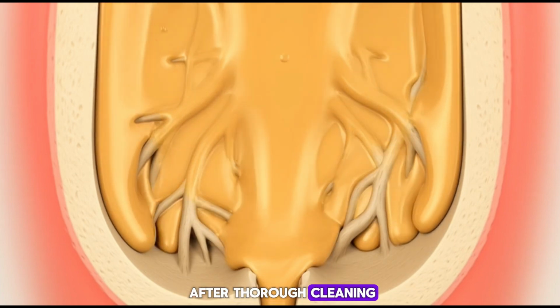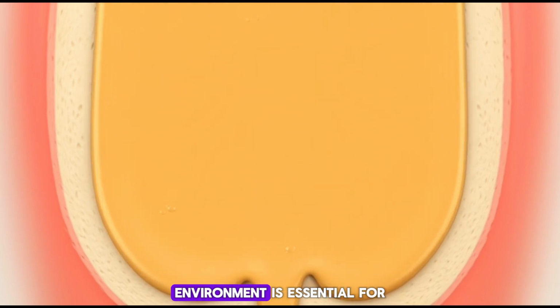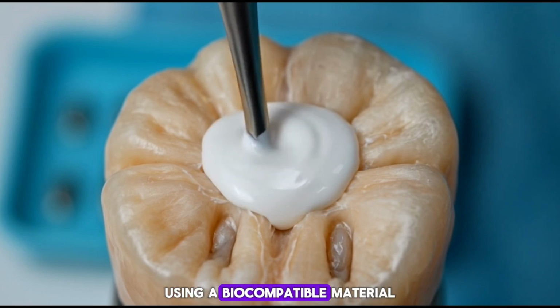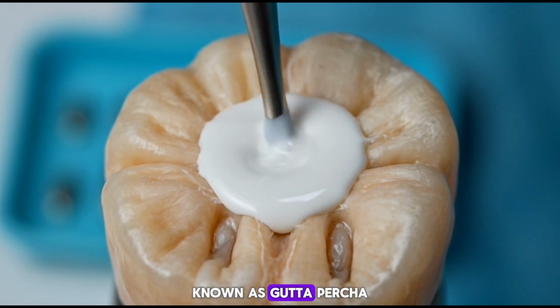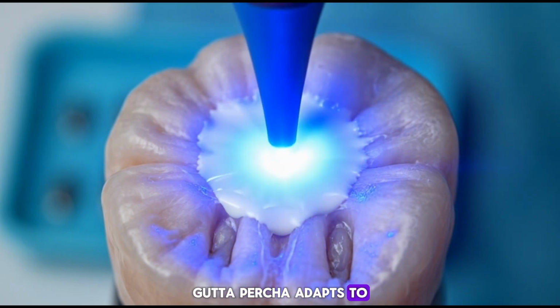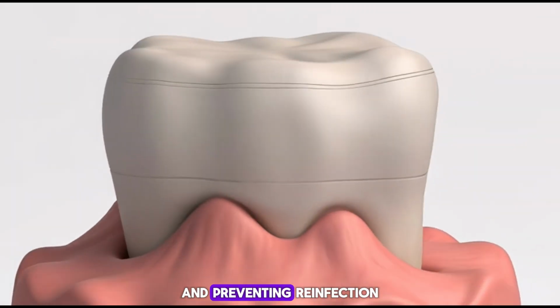After thorough cleaning, sterile paper points dry the canals completely. A clean, moisture-free environment is essential for a secure seal. The canals are then filled using a biocompatible material known as gutta-percha, combined with a sealing cement. Warm gutta-percha adapts to the intricate canal anatomy, sealing from the chamber to the root tip and preventing reinfection.